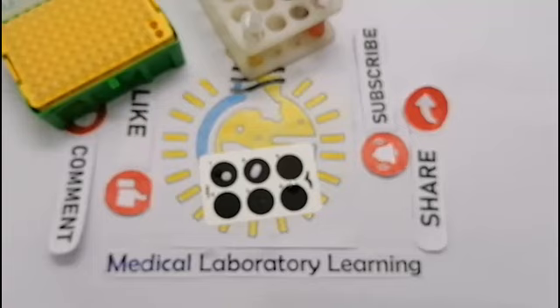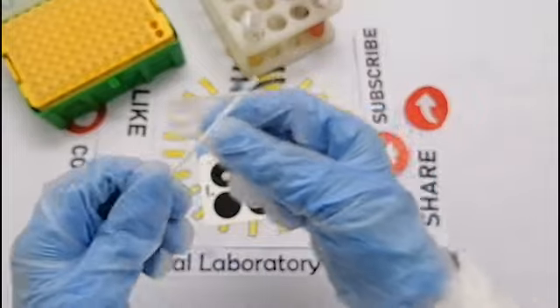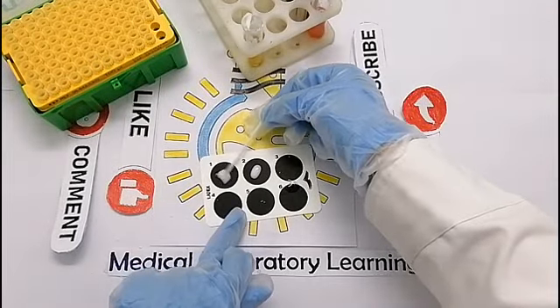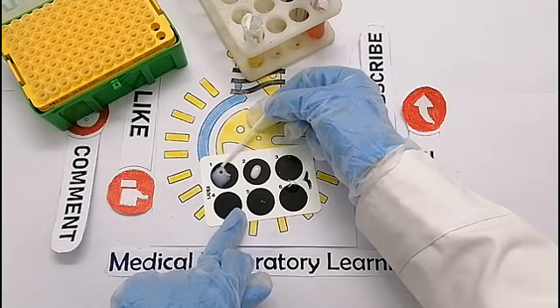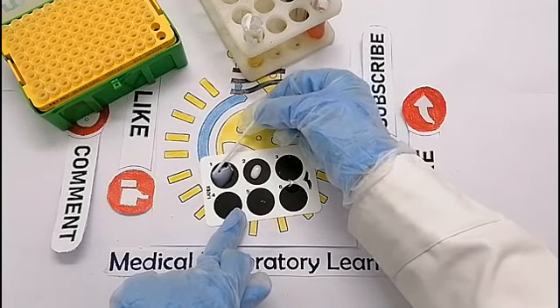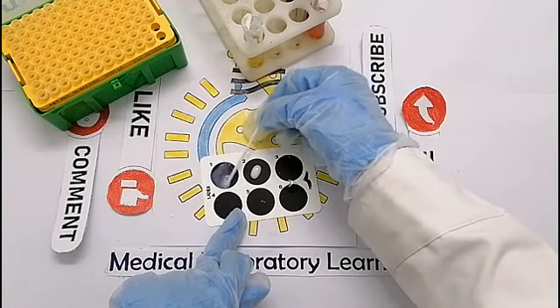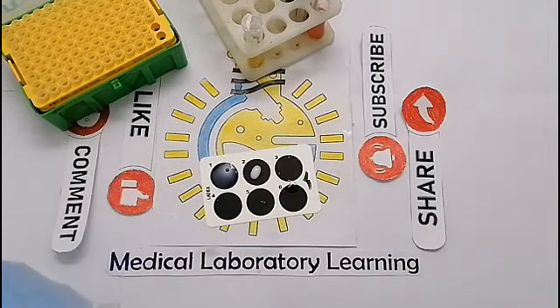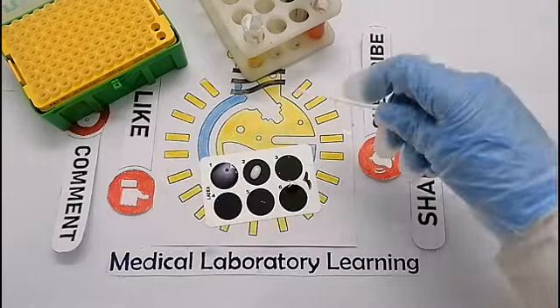Remember that this test is based on agglutination. The solution we use for observing agglutination in this test is latex. And since latex is white, the slide we use for this test should be black to allow clear observation of agglutination.